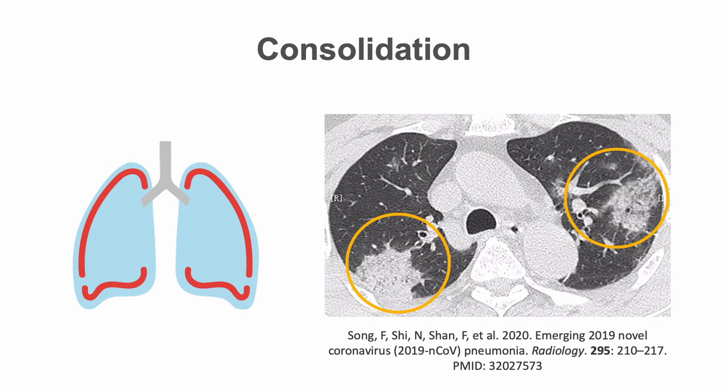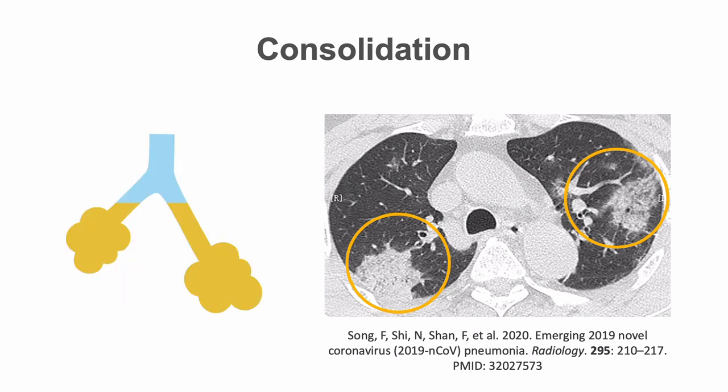Bilateral, peripheral, and basal lung consolidations are also commonly seen, indicating a complete filling of the air spaces by inflammatory exudates. It is common to see both ground glass opacities and consolidations in patients with COVID-19. Ground glass opacities are the main findings, but they can coexist with consolidations or evolve to consolidations. Sometimes, a COVID-19 positive patient may show only consolidations on chest CT.